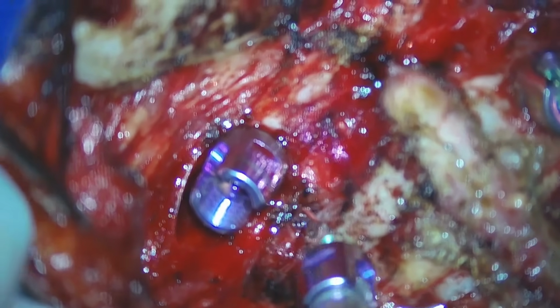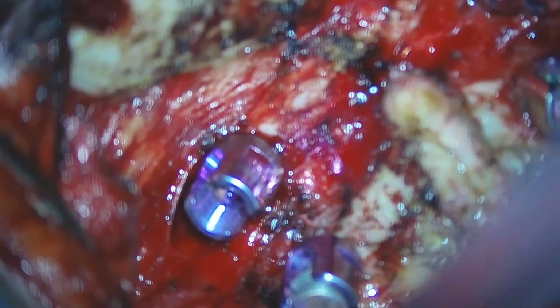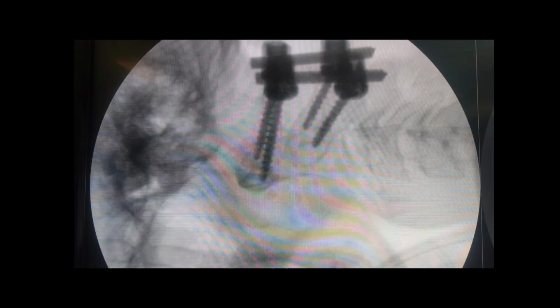And once it is done, the next step is fixing the screws with a rod. The post-op X-rays show there is a good reduction in the fracture segment along with immobilization of the C1 C2 joint.